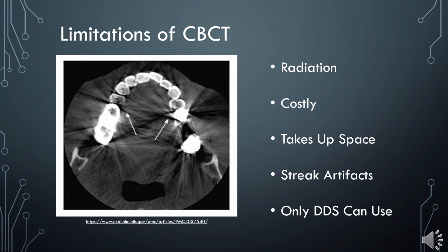CBCT should only be used where 2D imaging is insufficient. It has a higher cost and radiation exposure, and metal artifacts such as restorations and implants cause streaks and dark zones, which affect image quality and may mimic disease.